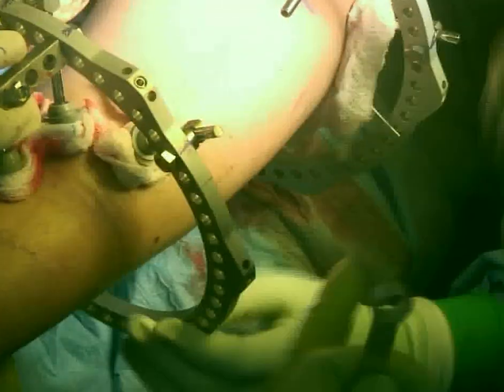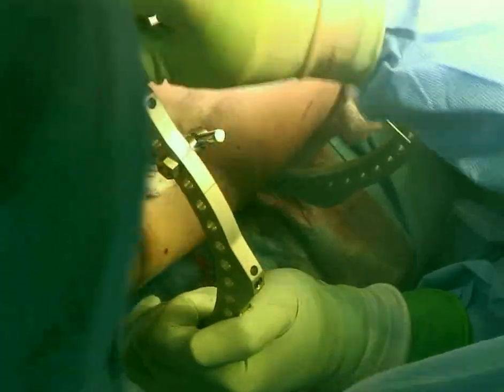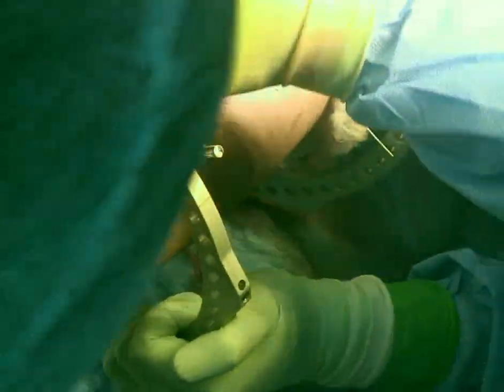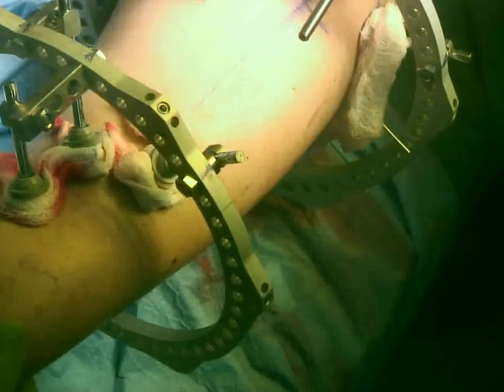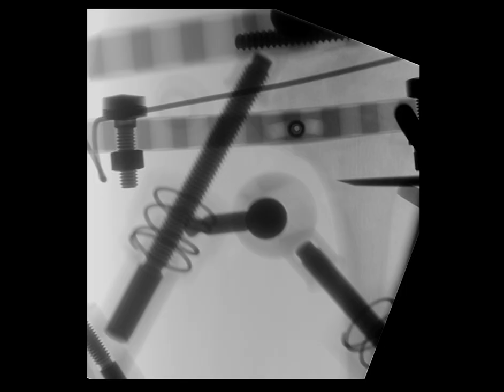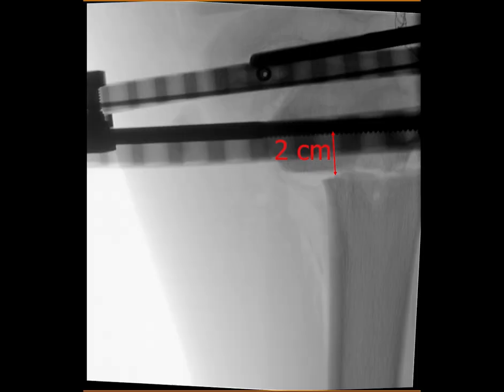We put a second ring perpendicular to the tibia, and we connect these 2 rings with the struts. We remove the front struts to do the osteotomy of the tibia, and we usually choose a place for the osteotomy around a centimeter, 2 centimeters distal to the distal pin of the proximal fragment. And we ensure our osteotomy is complete by seeing translation both on the AP and the lateral view.